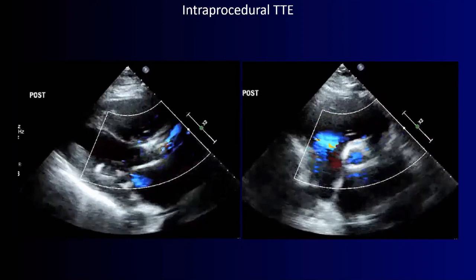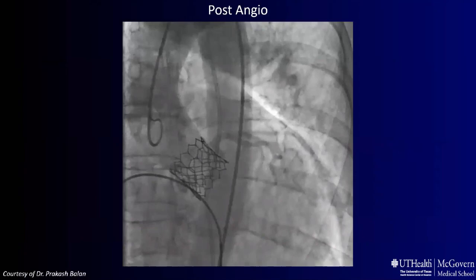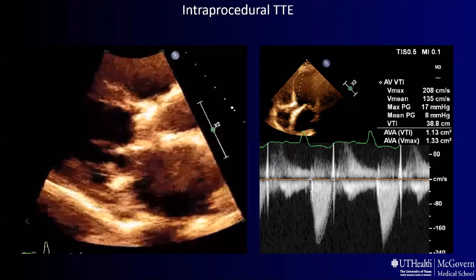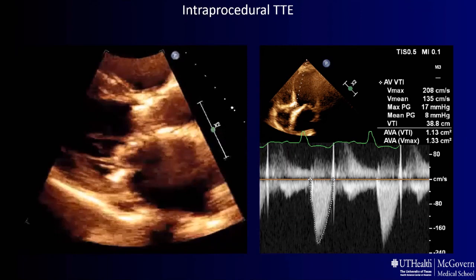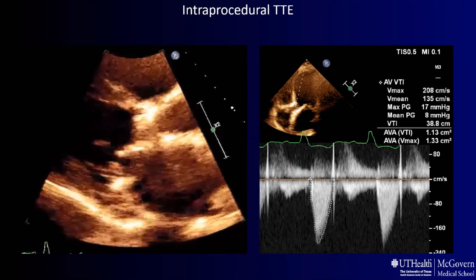Immediately after valve deployment the sonographer takes images looking for any issues, complications, or significant paravalvular regurgitation. You can see a little bit of regurgitation that is intravalvular and related to the wire still across the valve. Angiography may also be performed to assess for significant regurgitation. Prior to the patient leaving the lab, a comprehensive hemodynamic evaluation of valve velocities and evaluation for paravalvular aortic regurgitation from multiple views is performed. Post-procedure imaging with TTE includes assessment of the ventricles, valve structure, position, stability, motion, expansion, shape, any regions of separation between the valve stent and the annulus, valve hemodynamics, and the presence of any paravalvular regurgitation — its severity and location.